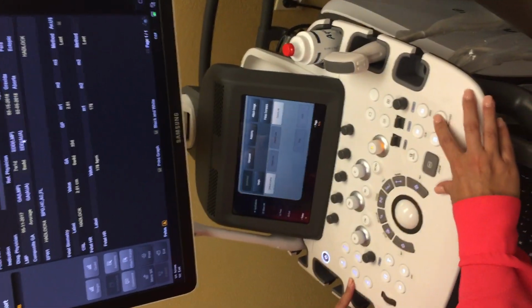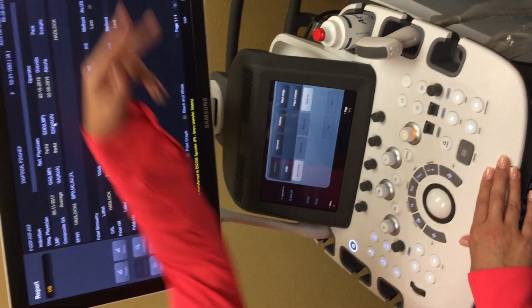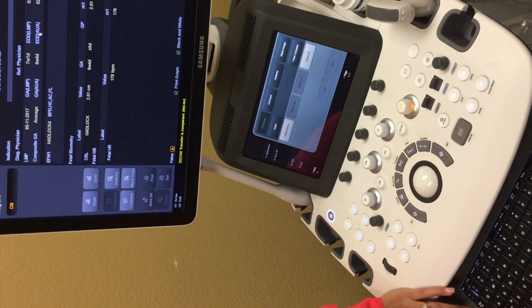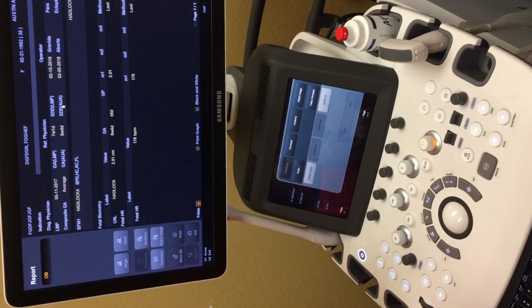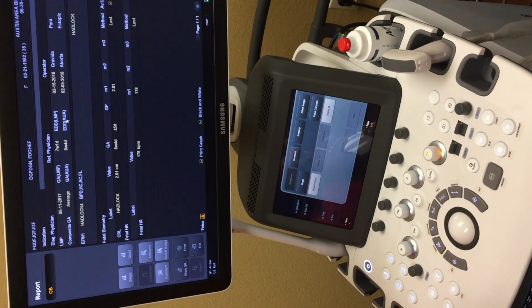And then, of course, you can save and print an image of that. That's nice because then you've got that image there. And that'll print out on the thermal. Exactly. Is that thermal paper expensive? Should I be worried about printing out a bunch of pictures? I mean, it's like $65 for a box. It's pretty expensive, but if you're printing 1 or 2 or 3, you're fine.